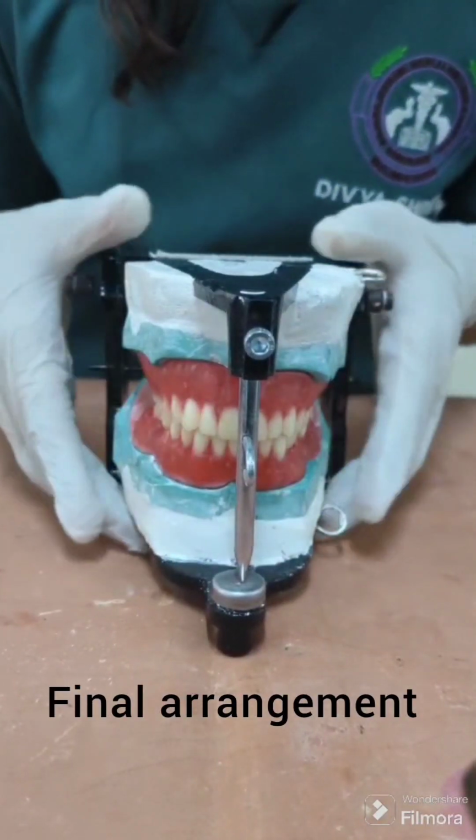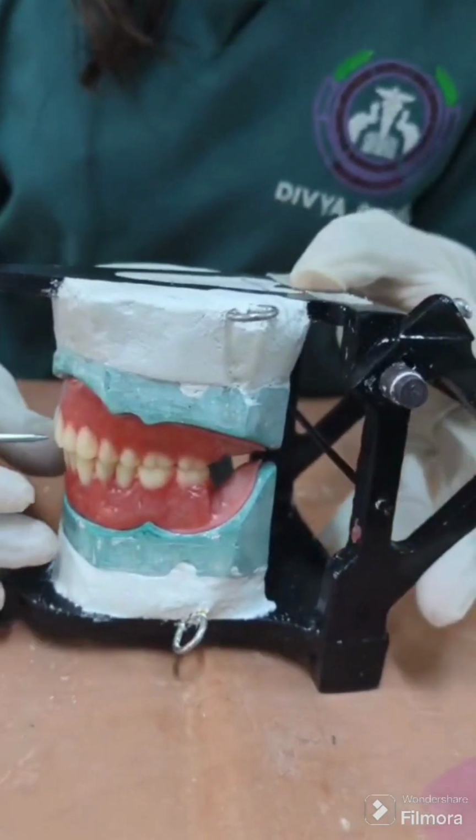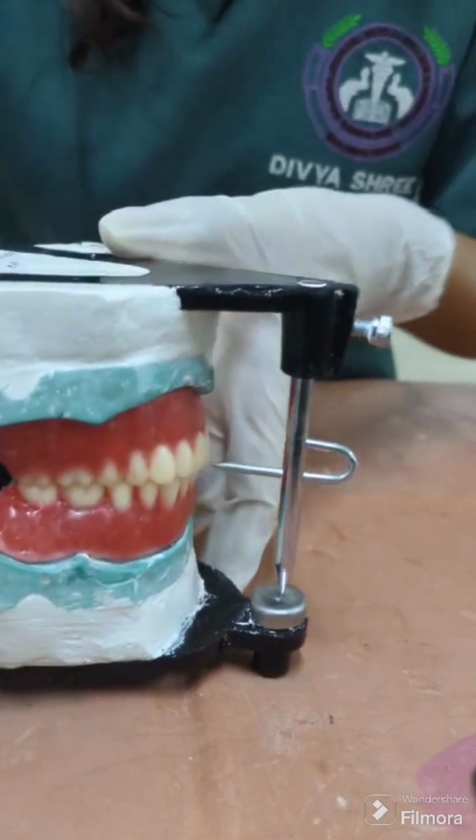The mandibular posteriors should be arranged in such a way that they are in perfect occlusion with the maxillary posteriors. This is how a final arrangement should look.